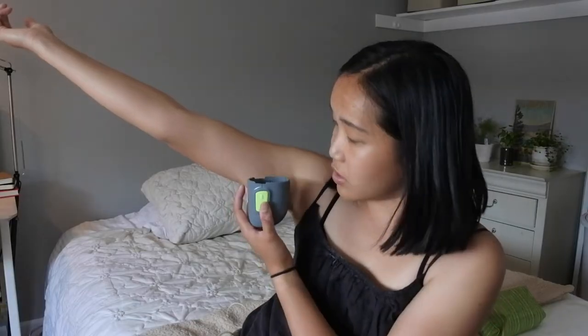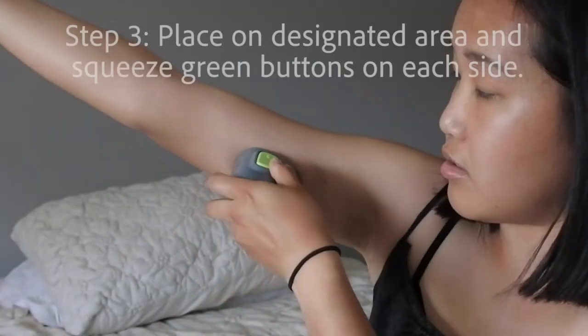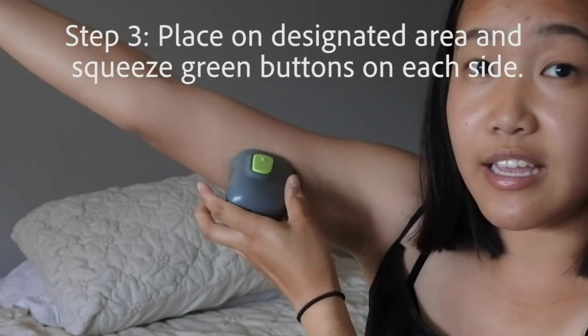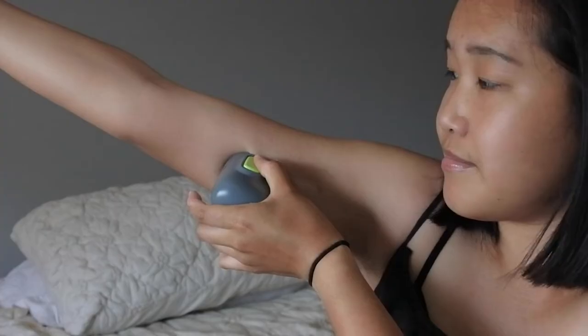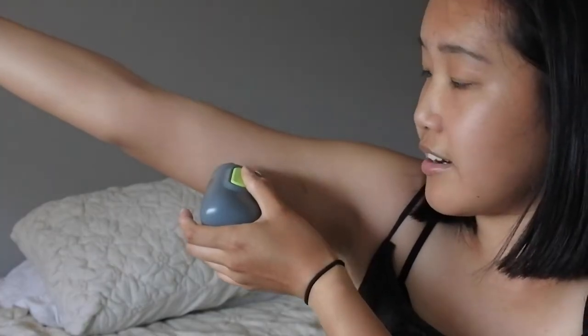All you're going to do is get your arm, put the inserter on top, and push down the two buttons on the sides. I'm going to put it flat down and press the two side buttons. You'll hear a little click.